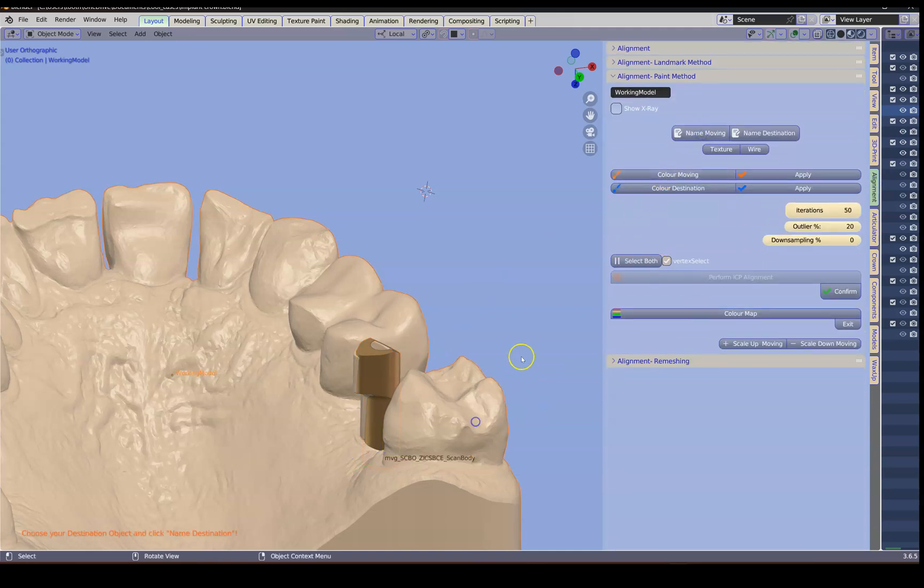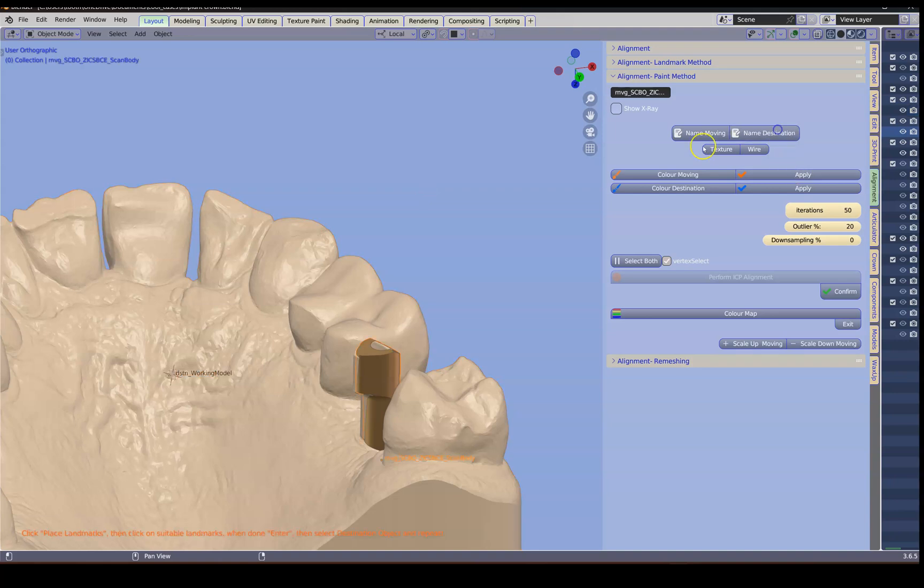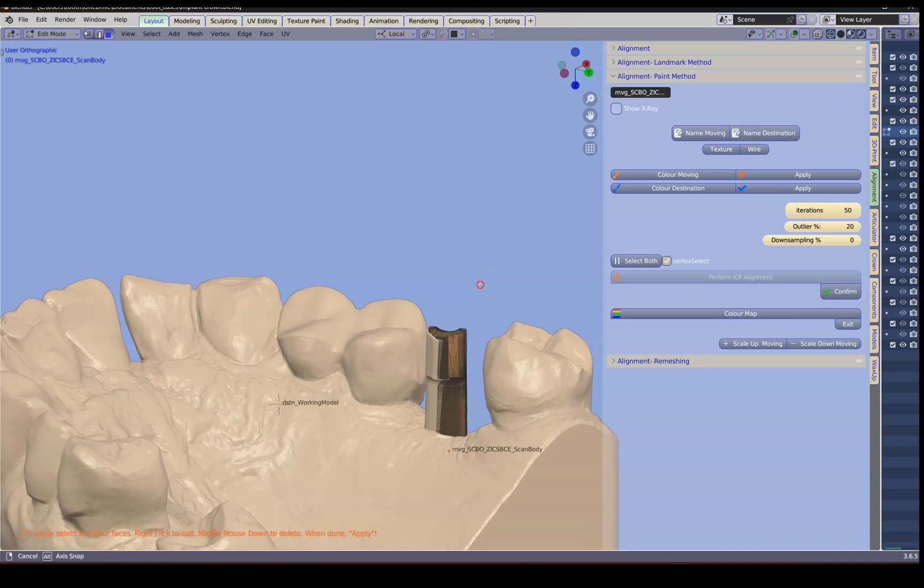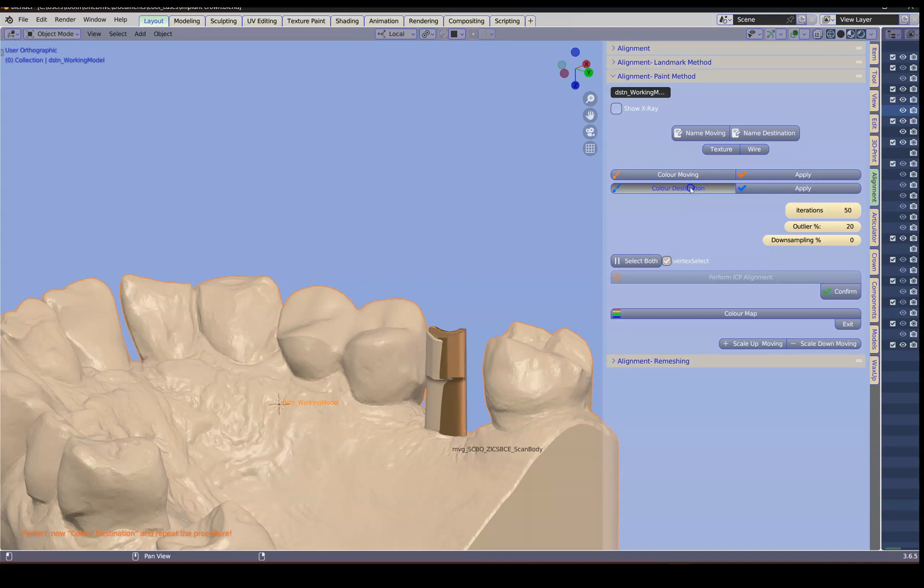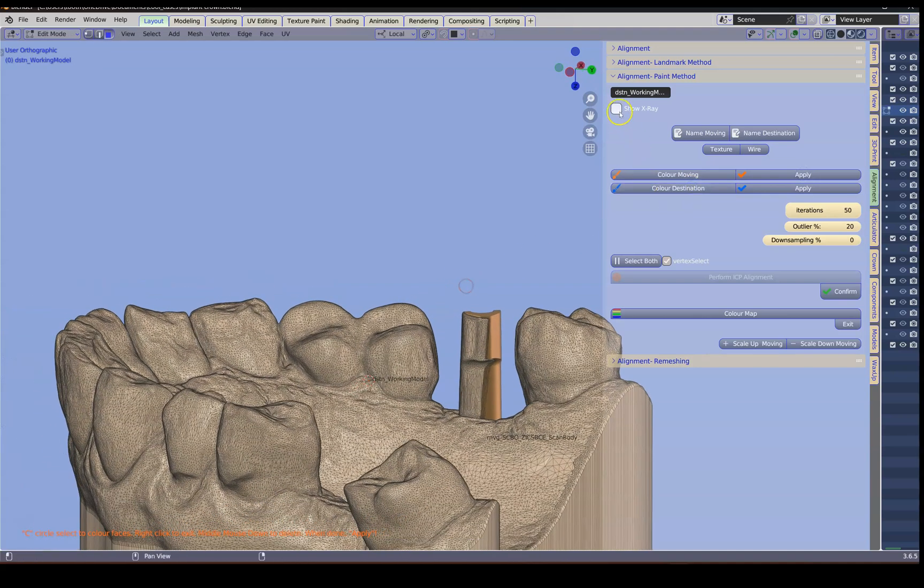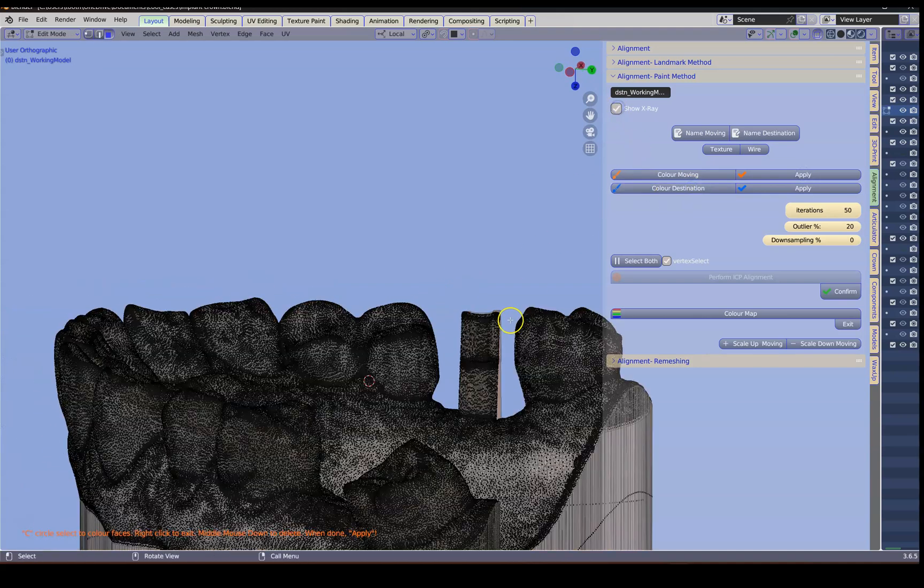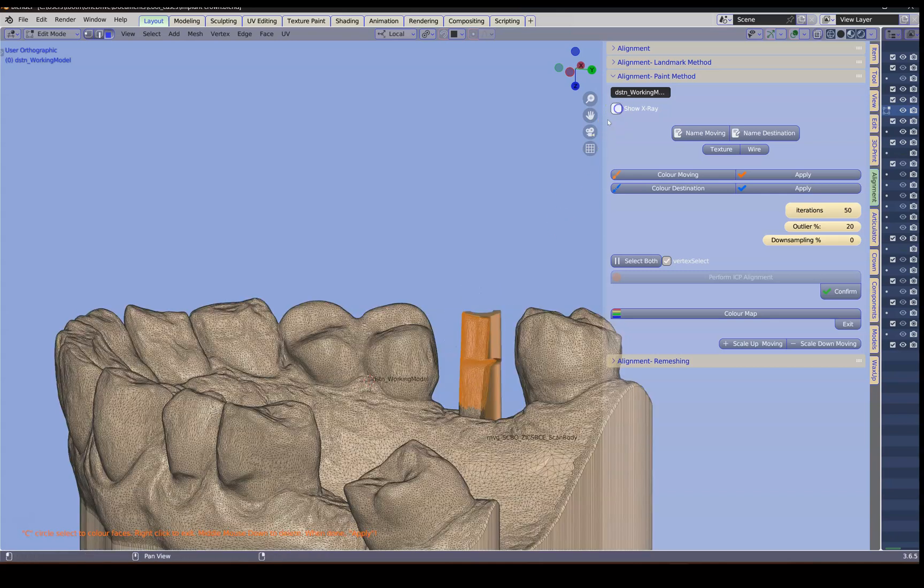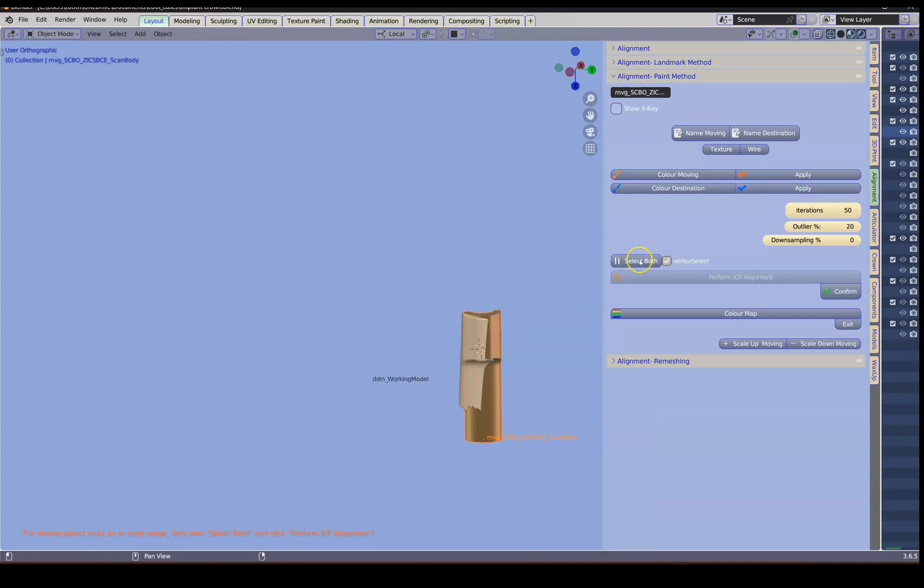And this is my destination. We're going to color the moving. So I'm going to select all, A to select all. And then we're going to apply that and color our destination. I'm going to go into transparent mode. Use C key. Brush off all of these vertices to make sure they go on the other side. Apply. Select both and perform ICP.